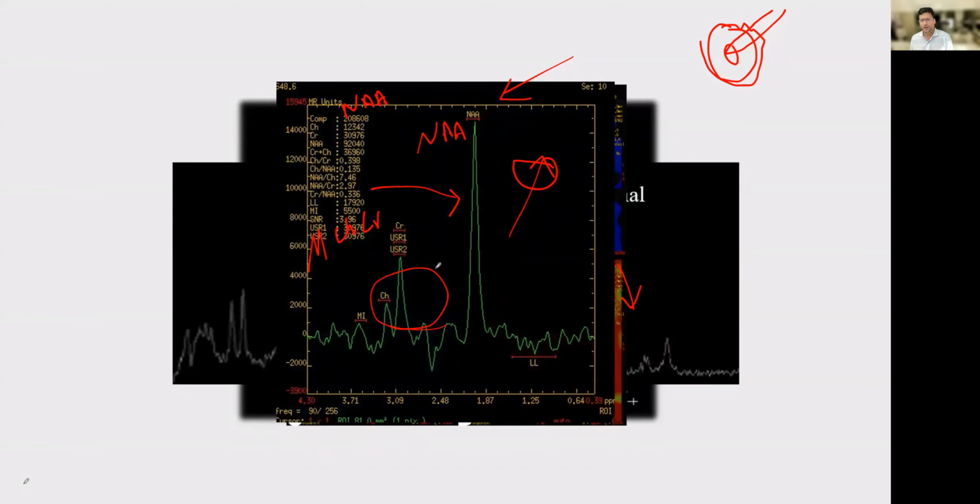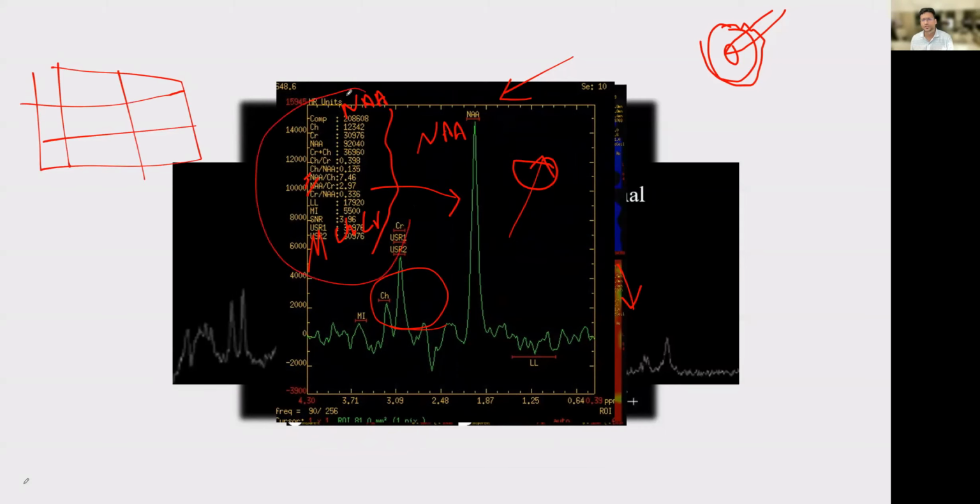Again, after that, you have to look at the individual peaks. See the ratios here. This is again a GE MR. You are seeing the creatine to NAA ratio, NAA to choline ratio. Some newer vendors like United Imaging give this clearly in a tabular form, which can be relatively challenging for juniors, but the tabular column is easier. We can look at the choline to creatine ratio and choline to NAA ratio here on this side of the bar.